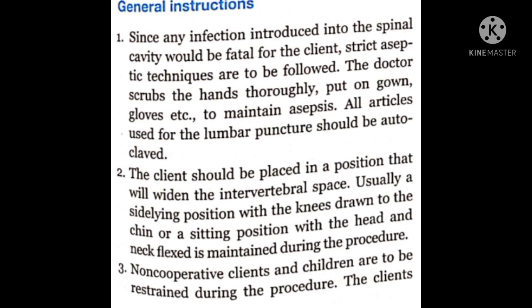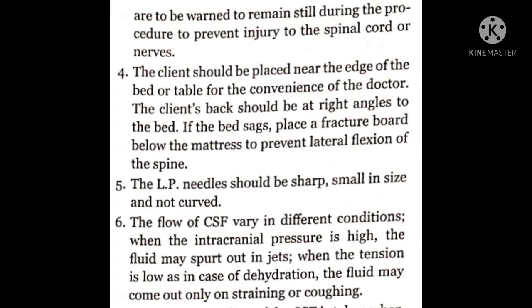2. The client should be placed in a position that will widen the intervertebral space. Usually a side-lying position with the knees drawn to the chin or a sitting position with the head and neck flexed is maintained during the procedure. 3. Non-cooperative clients and children are to be restrained during the procedure to prevent injury to the spinal cord or nerves.